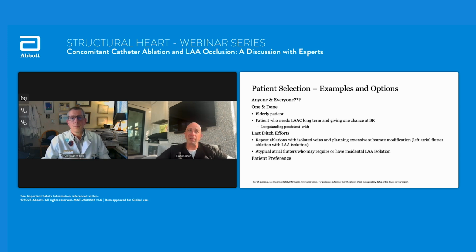So why don't we plan to close it at the same time? So we typically do that. And so those are the patients I'm really thinking about when I see them in clinic. Obviously, this patient preference is a big thing. I get asked over and over again, can we do these at the same time? Or, hey, I've heard about this closure device. Can you do that at the same time so I can come off anticoagulation? So those are just a few of the patients, obviously, that I think about.